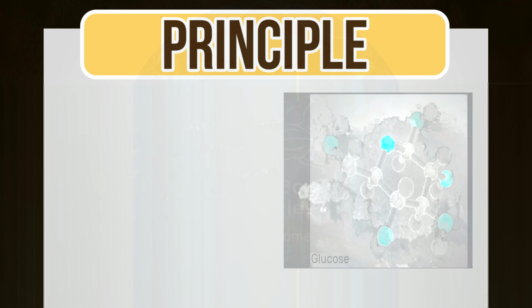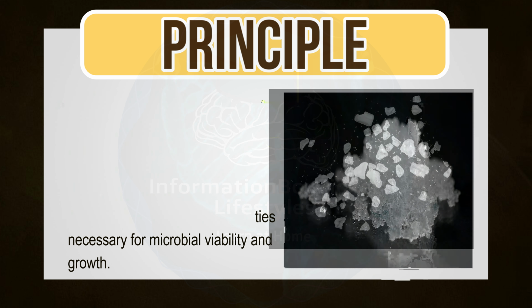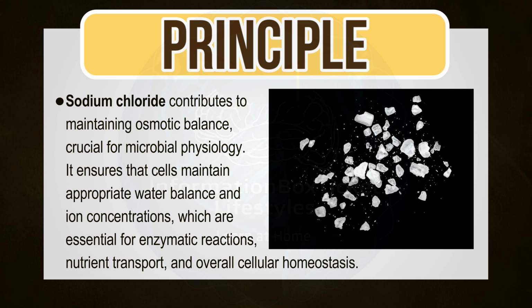Sodium bisulfite acts as a reducing agent within the medium. By maintaining a reducing environment, it helps to preserve the integrity of sensitive compounds and enzymatic activities necessary for microbial viability and growth. Sodium chloride contributes to maintaining osmotic balance, crucial for microbial physiology.